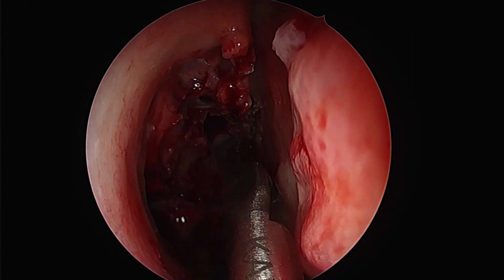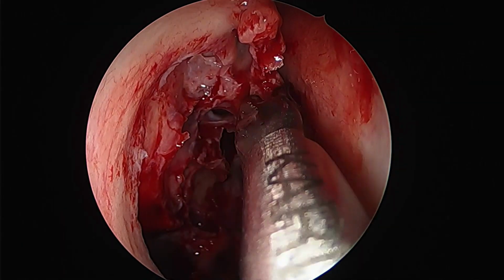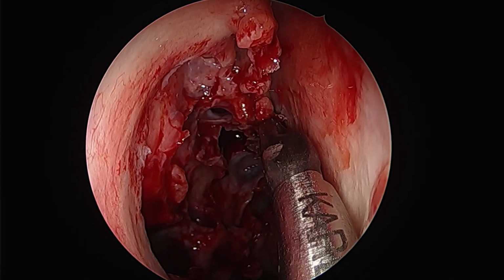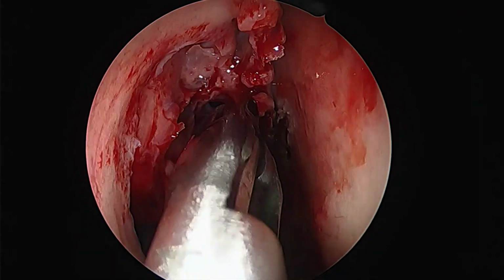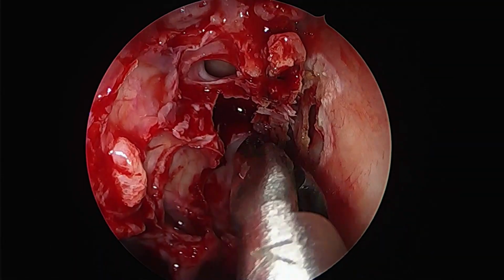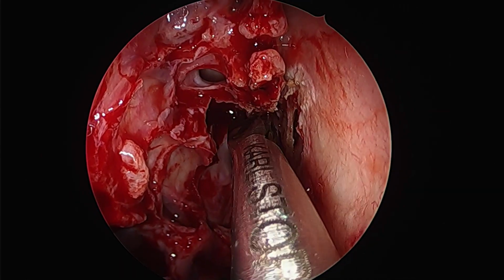As we see here, almost all sinuses have been opened, though not flush. So here we can use a combination of instruments such as straight and angled through-cuts to remove the septations even more, and then use eventually the drill to take down further septations and to create a flat surface for reconstruction.